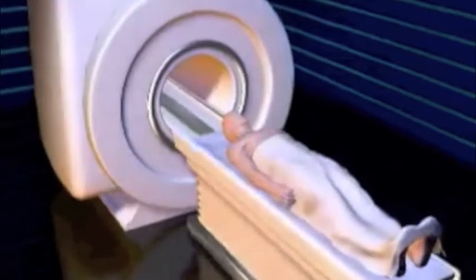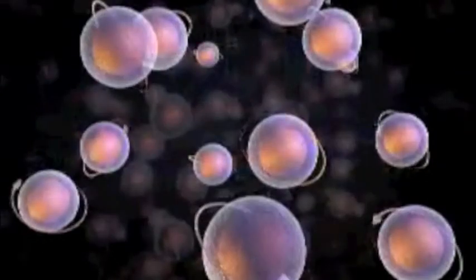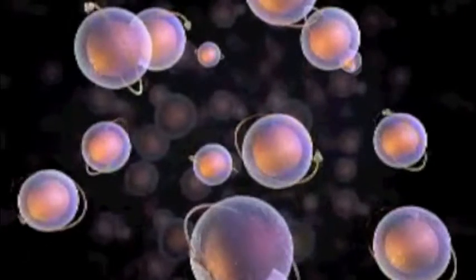In an MRI machine, there is a magnet, a gradient coil, a radio frequency coil, and a receiver. In the machine, the magnets cause the water molecules in the patient's body to be polarized. This then causes them to vibrate at a certain frequency. This concept originated from the equations that were formulated by Joseph Larmor. He discovered that strength of the magnetic field is proportional to the angular frequency of precession. This means that the stronger the magnetic field, the higher the frequency is.